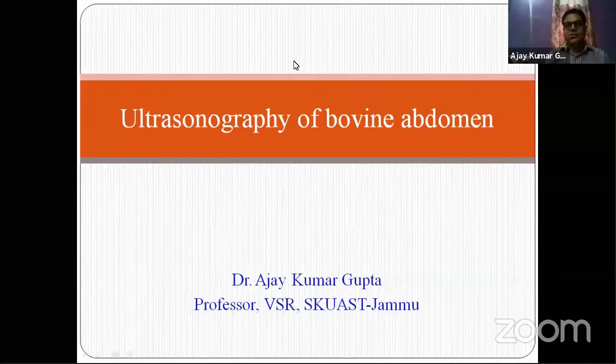Respected faculty members and dear participants, today I'm going to deliver my lecture on ultrasonography of bovine abdomen.